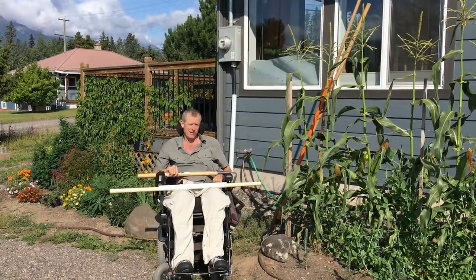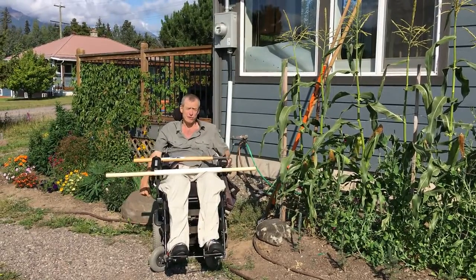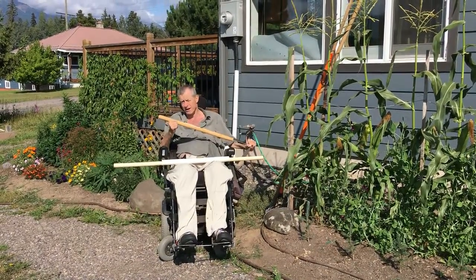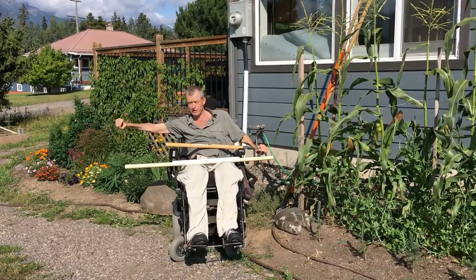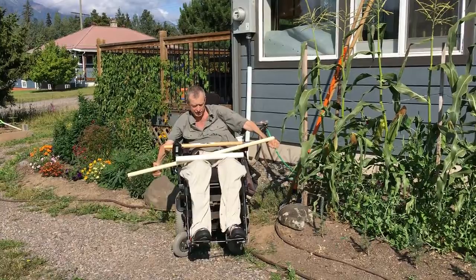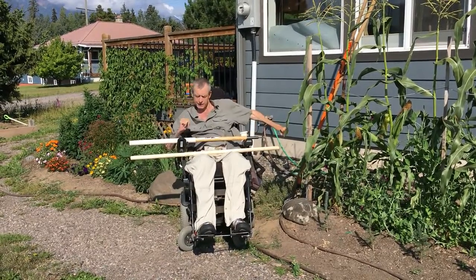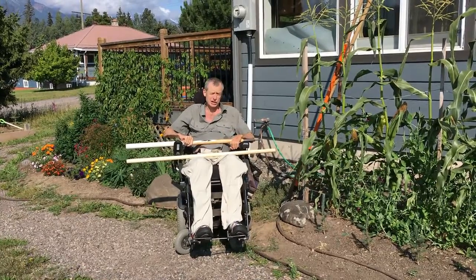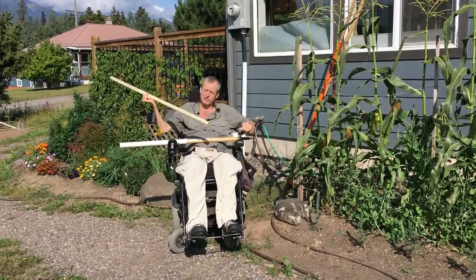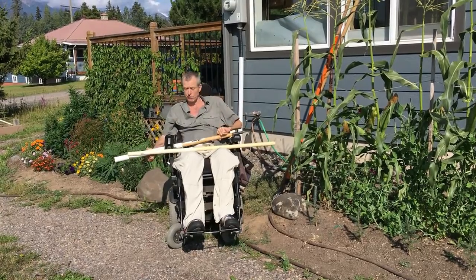Okay, so my favorite tools in gardening are a hoe, a rake, and a stirrup weeder is what I call it. All these tools come with about a 4-foot handle on it, so the idea is just to extend the handle in one way or another. So the hoe handle I cut off because this far end went kind of in a curvy taper type of thing, and I'm going to extend it with a 4-foot piece of wooden doweling here. And how I'm going to do that is I'm going to take this pipe, I'm going to stick it on the end like that. I'm going to take some thin plastic, like something from a vinegar jug or an ice cream tub, and I'm going to jab it in there just so it tightens up this pipe onto the wood. And then I'm going to stick this 4-foot long piece in the other end and put a couple set screws in it. So it'll end up being about a 6-foot long handle.